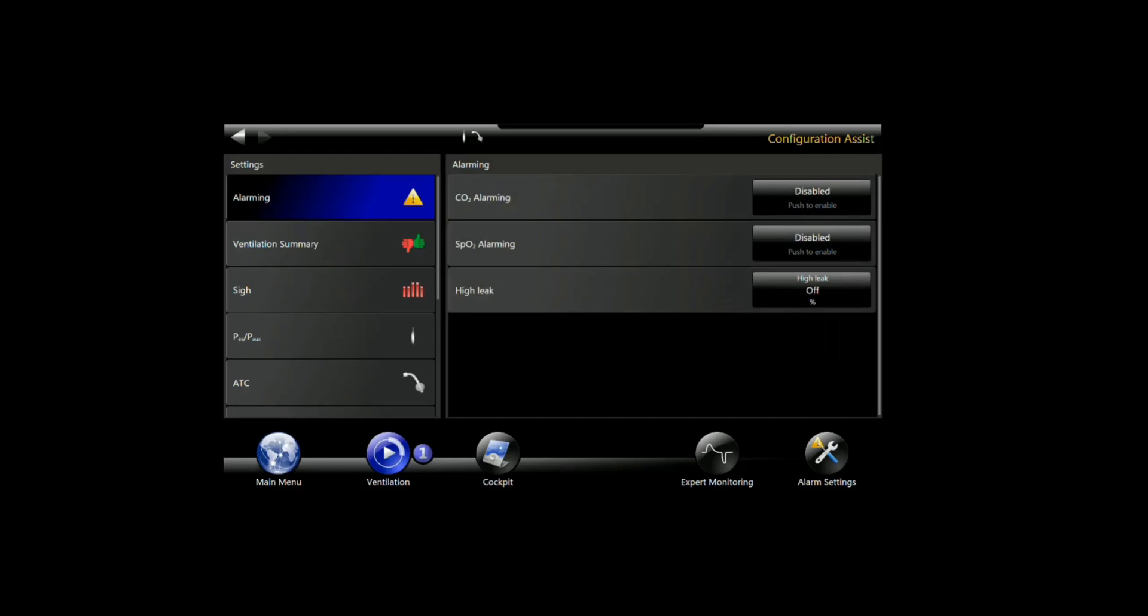Although we've connected the sensor to the ventilator, the ventilator will not provide alarms for carbon dioxide unless we go here and enable it. We're going to go ahead and enable those alarms.